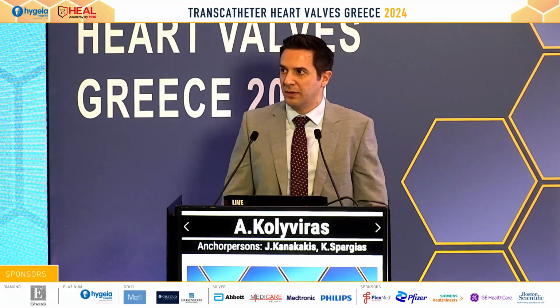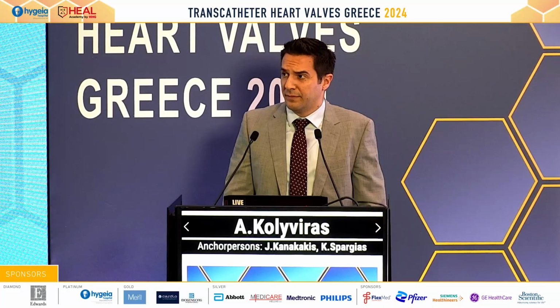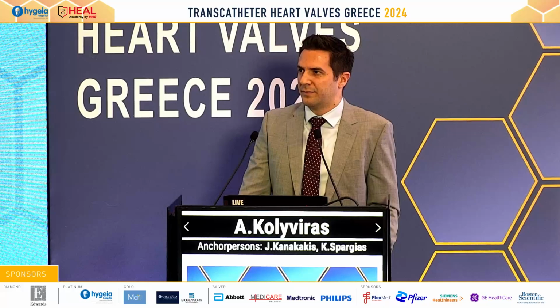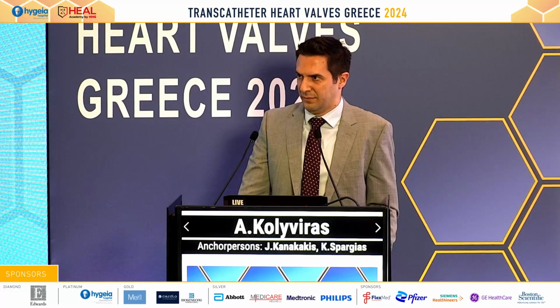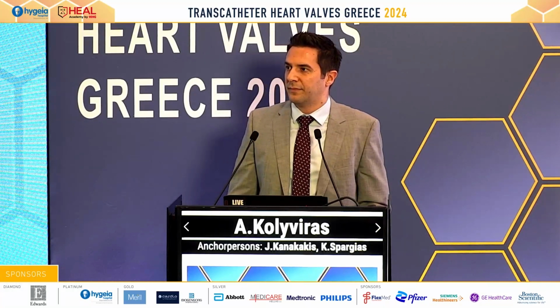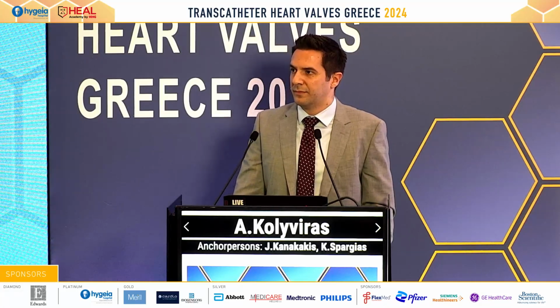For the 14 French sheath, for the transcatheter aortic valves, many of them are working with a 14 French sheath. The one ProGlide approach is working, it's safe. But if there is calcification, posterior or medial or lateral, the angles of the ProGlide change when you use a two ProGlide approach. This is very well published by Gilbert Tang. The place of the calcification on CT is very important. Sometimes there is posterior and medial calcification, then you put the ProGlides at 11 o'clock and 2 o'clock. And if there is lateral calcification, 1 to 3 o'clock, and one on the opposite side.